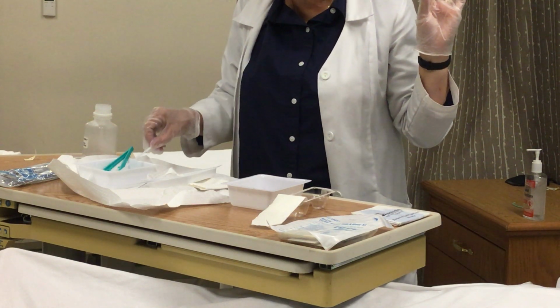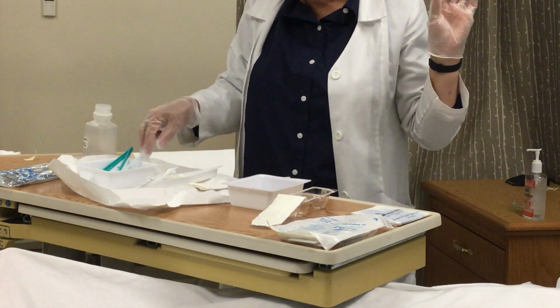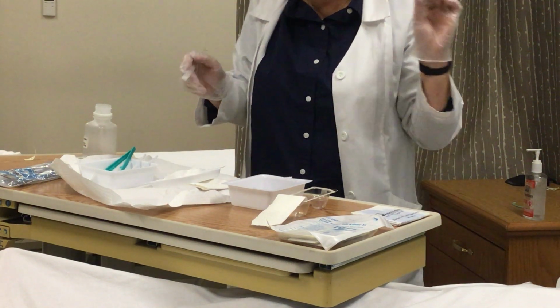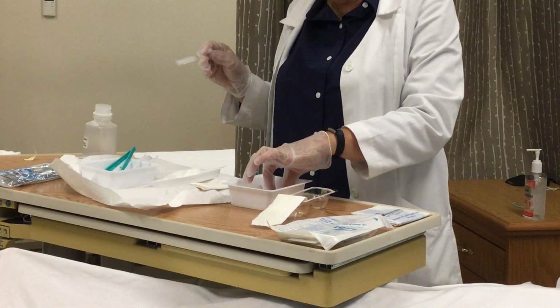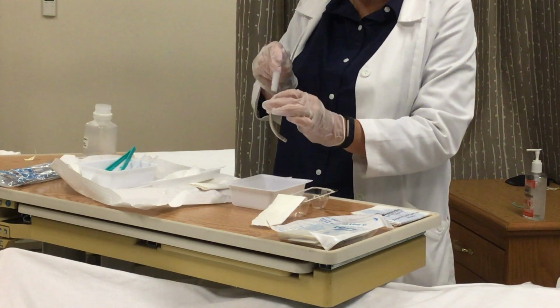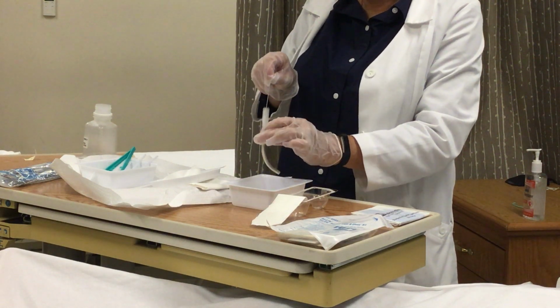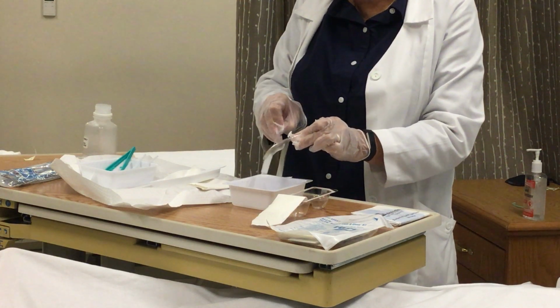It comes with some pipe cleaners, and then it has a little tiny bottle brush that you can use for that. I'm going to pick up the inner cannula just by the outer portion of it, like I took it out. I'm going to stick the little bottle brush in. Keep it kind of low to your basin, otherwise it splats all over.